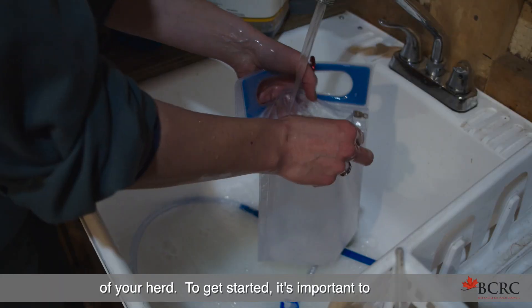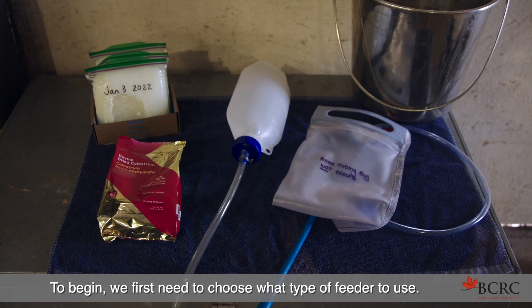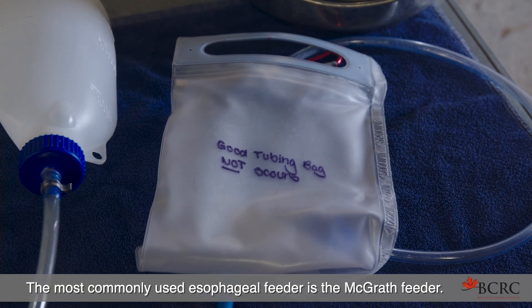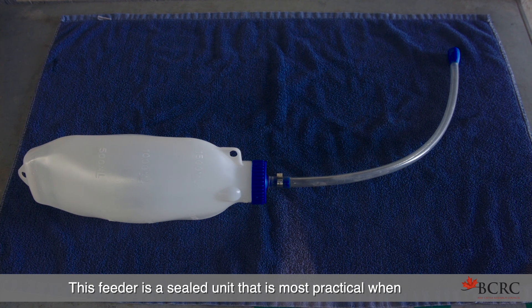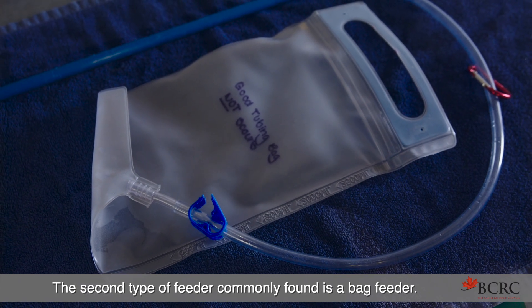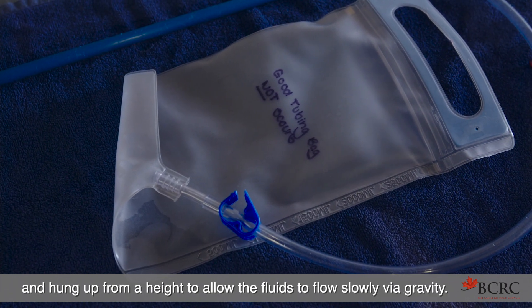To get started, it's important to have your supplies clean and ready to use. There are two standard types of feeders. The most commonly used esophageal feeder is the McGrath feeder — a sealed unit that is most practical when handling calves by yourself. The second type is a bag feeder, which allows fluids to be poured into the top of the bag and hung from a height to allow the fluids to flow slowly via gravity.